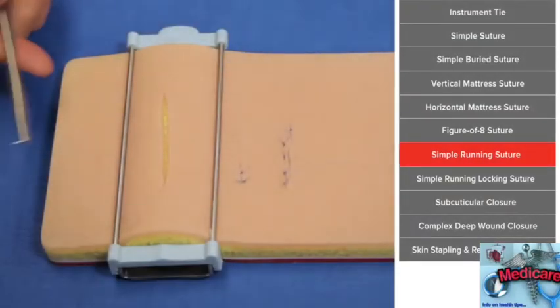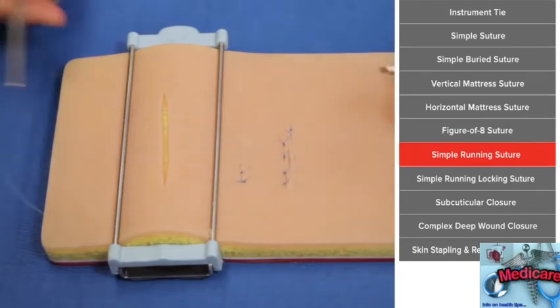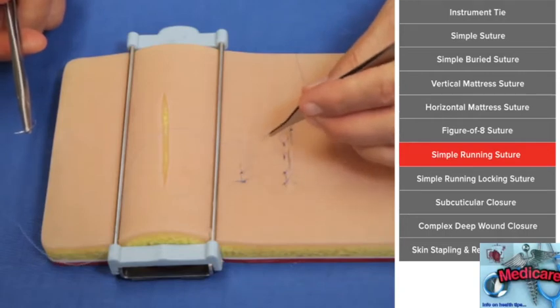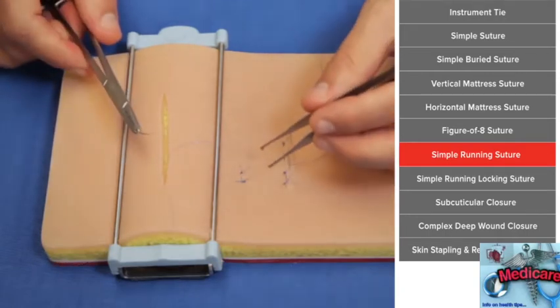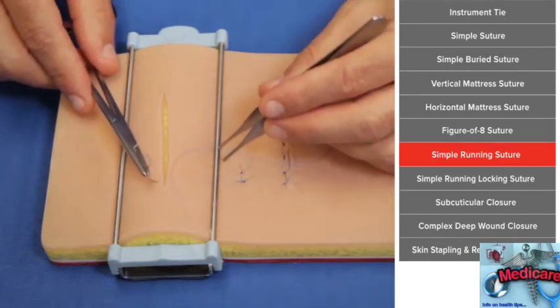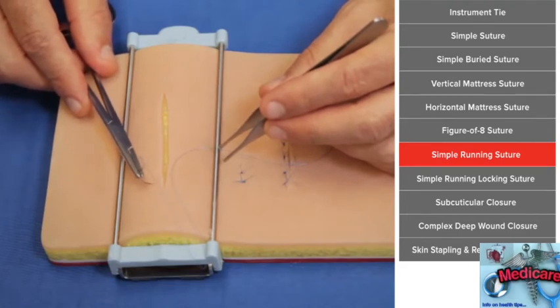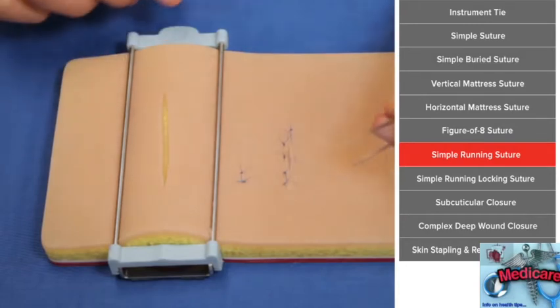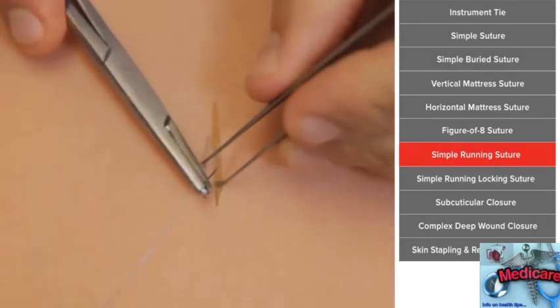Next, simple running suture. Now we're moving along. You're becoming a proficient suturer with your simple sutures. You could just put a series of simple sutures and you'll close a wound much faster. I liken this to a sewing machine. You'll want to take the exact same bite each time and advance the same amount each time. That's how you get an incision closure to look pretty.